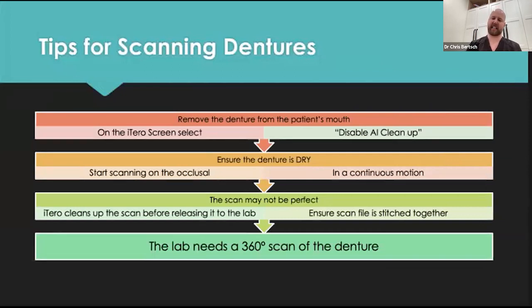And then when you start scanning, there's a video coming up. It's so important to scan in a continuous motion. If you're scanning and holding it in one place for too long, it's taking too many images and it can't digest it all, so it starts glitching out. It's really slow, and then it just becomes really frustrating. So the smoother the motion you can go and continue to scan, the better, capturing a few planes of motion.